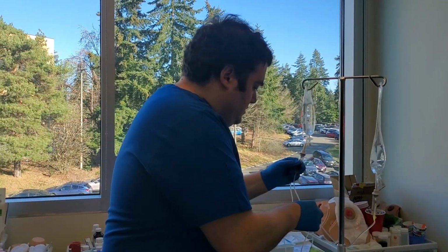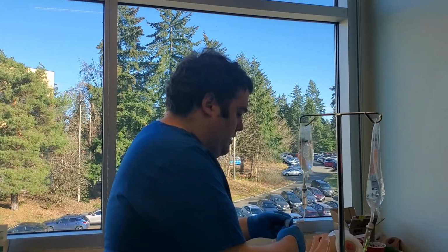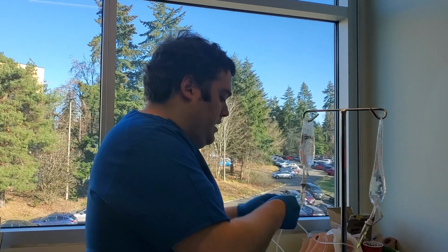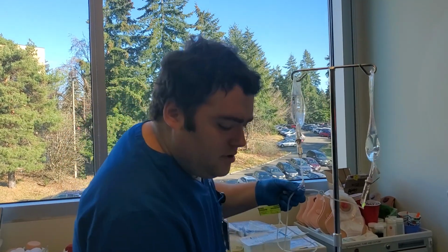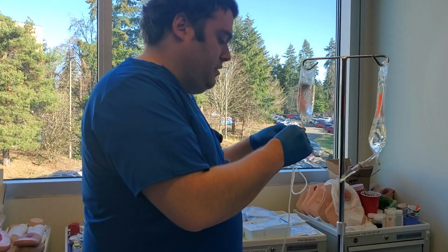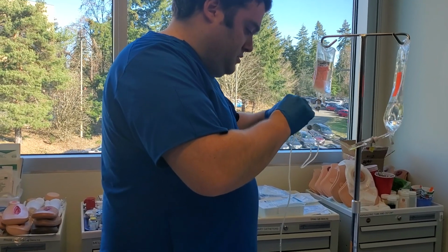We'll do this for halfway. Then we'll go ahead and we'll check for any air dry and the air bubbles. And now we're going to go ahead and connect. Connect here.